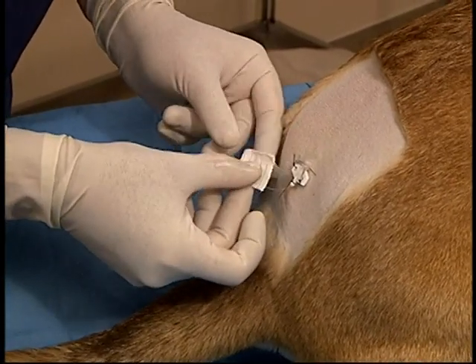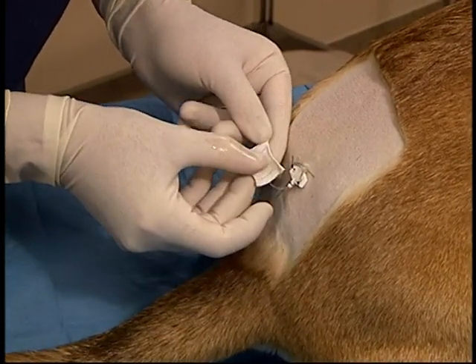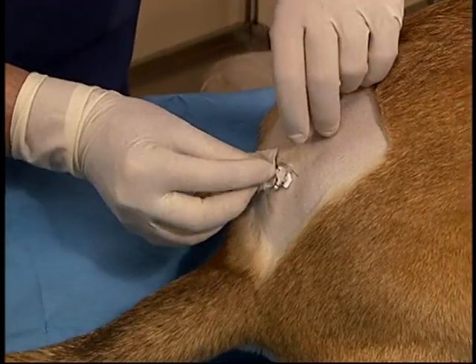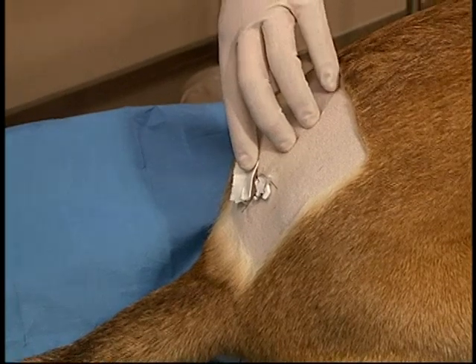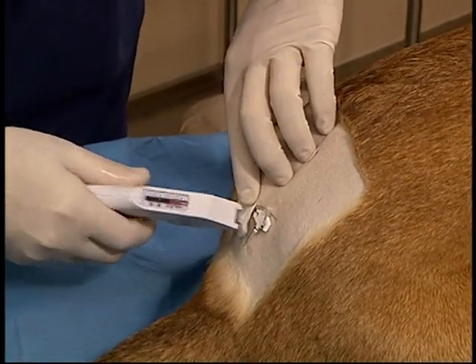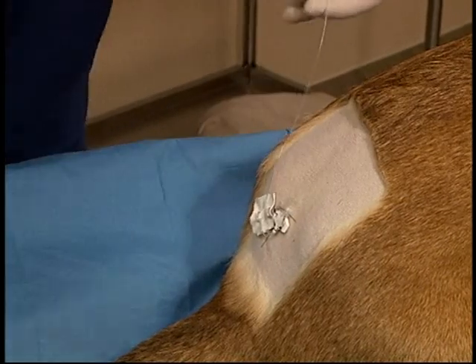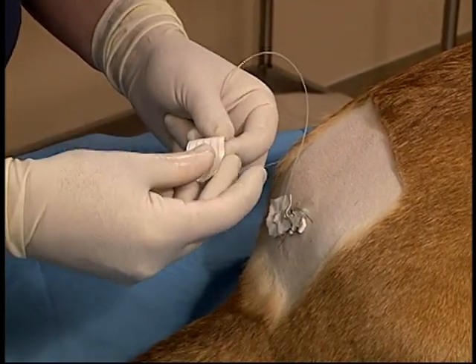To permanently secure this catheter, several tape tabs are placed over top of the catheter. These tape tabs are designed to create a stress loop so that if any kind of tension is placed on the catheter, it's not placed at the skin site, but is placed on these stress loops. These tape tabs are either stapled or sutured in place.